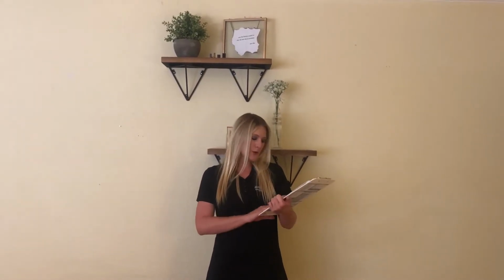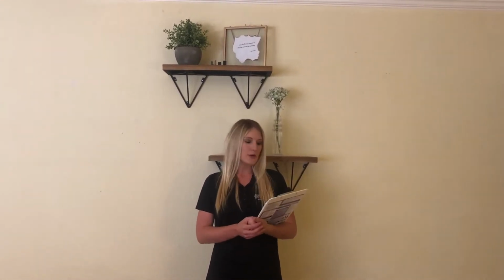Everyone. Today we are going to be demonstrating 3 assessments that can be used to assess your client's fall risk. Throughout these assessments, we're going to be following the CDC's STEADI tools guidelines to walk you through each of these assessments. This first one that we're going to show you is the Timed Up and Go test, also known as the TUG. This assessment is typically used to assess the client's mobility, and it is important throughout the assessment that the therapist observe the patient's postural stability, their gait, their stride length, and their sway.